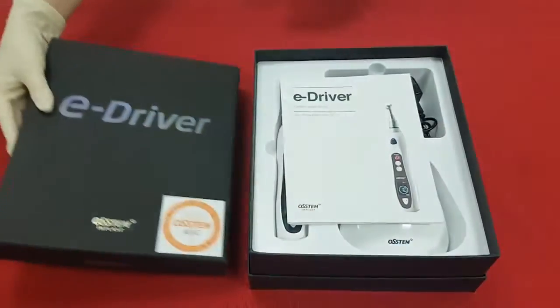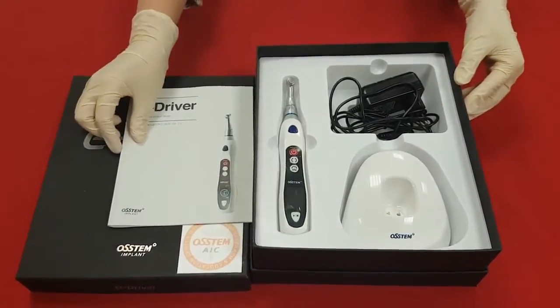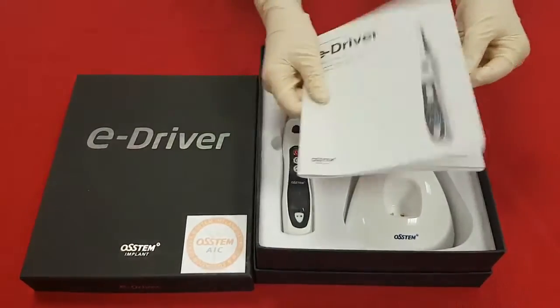When you open the case, you can find the manual, eDriver, power cable, and cradle. Please don't forget to read the manual thoroughly before you use it.